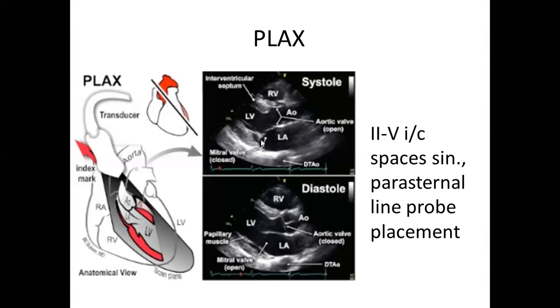And here are two schemes. So here is mitral valve, it is closed, and aortic valve is open. And as you can see, the cavity of the left ventricle is kind of narrowed a little bit. So this is systole of left ventricle.